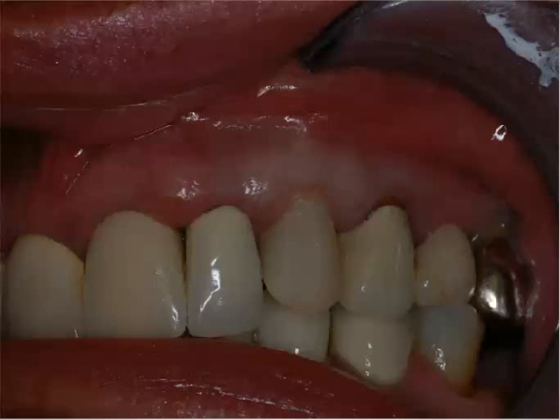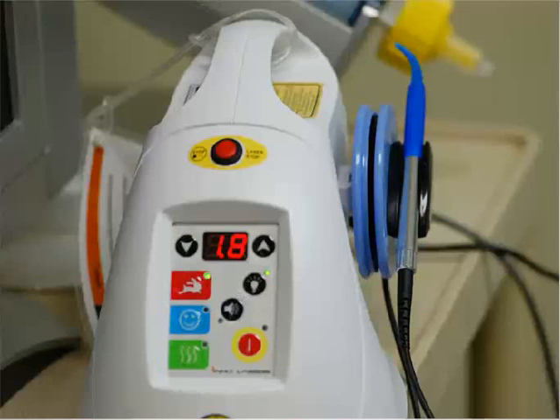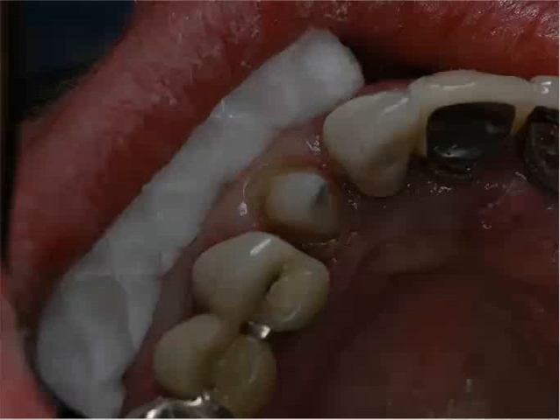But just to show you this and what we're going to be utilizing, we're going to be using this soft tissue diode laser. We use the 2 watt. The patient is anesthetized. It's only an end cutting instrument, and I'll show you that the fiber. It's not as quick as using electrosurge. It takes more time. It's less traumatic, does less tissue damage, less bleeding, and less potential recession. So when you come to anterior cases, that can be critical.